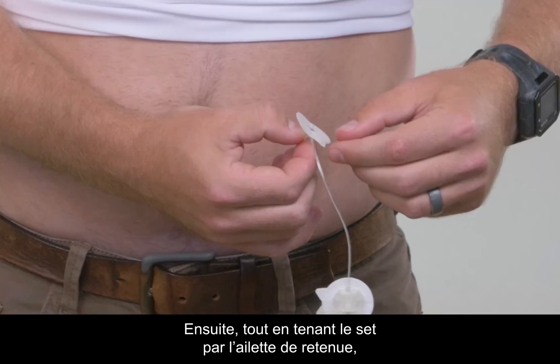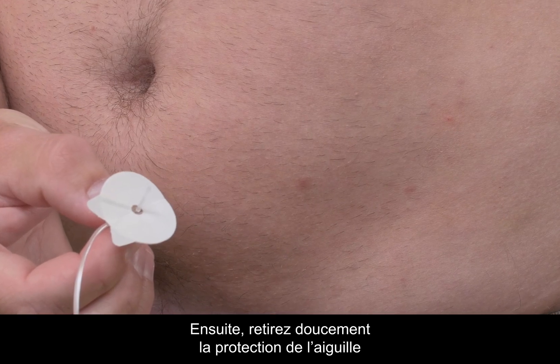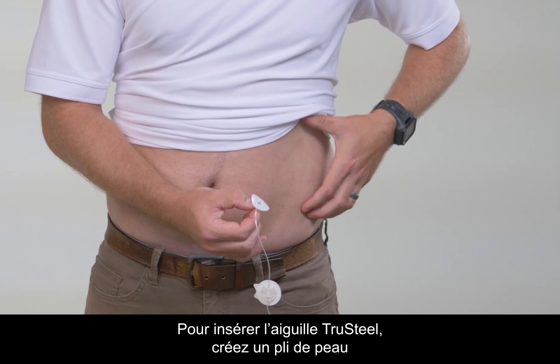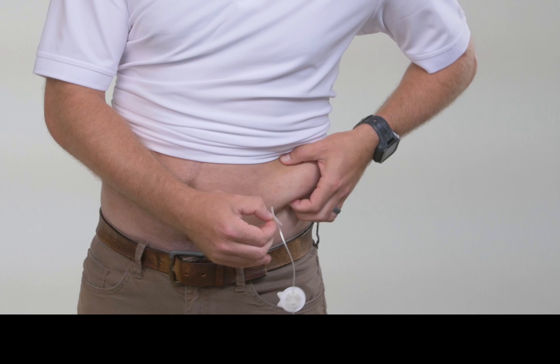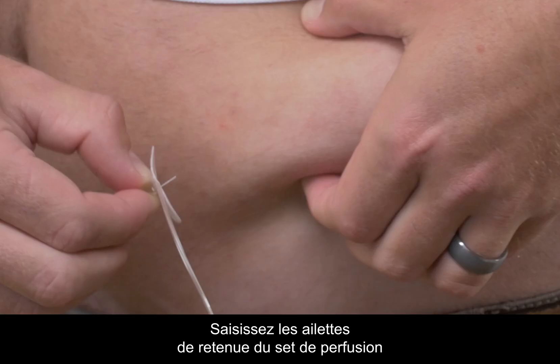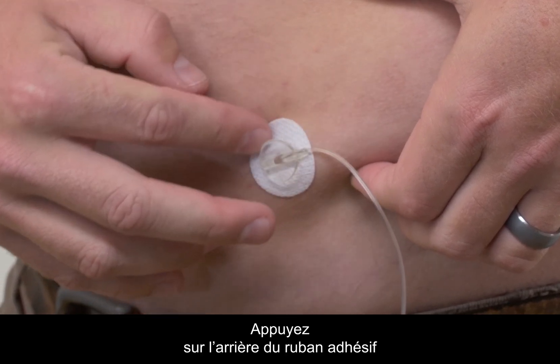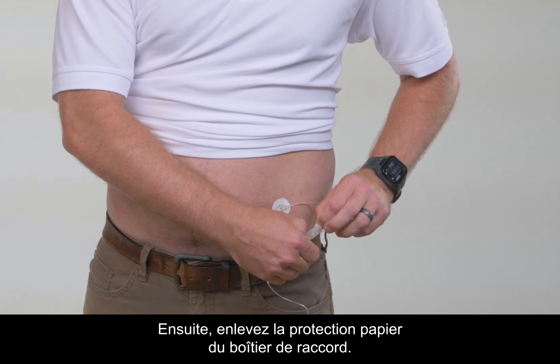While holding the set by the retaining wing, carefully remove the adhesive backing of the infusion set. Then carefully remove the needle guard by gently pulling it, taking care not to touch the needle itself. When inserting the True Steel needle, create a skin fold in order to reduce the risk of placing the needle in a muscle. To do this, pinch the skin at the insertion site with one hand. Grasp the retaining wings of the infusion set with the other hand and insert the True Steel needle straight into the skin fold. Press down on the back of the adhesive tape to secure the set to your skin.